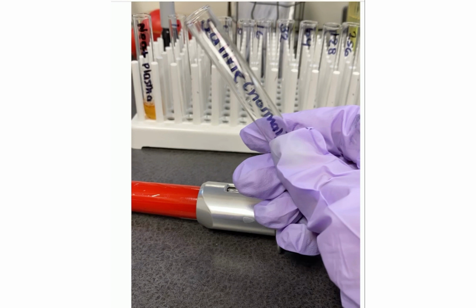So I'll take, as seen on the left side of the screen, a certain amount of neat plasma, about 1 to 2 mL. And then I'll create a saline tube, and I'll also create the reciprocal of serum dilutions. So I'll start with 1, then next 2, 4, 8, 16, 32, 64, 128, 256, and so on down the line. If I'm unclear about what the titer number will be, I'll do up to 512.